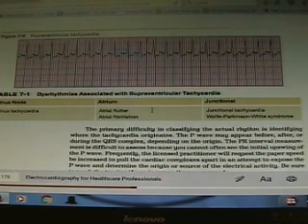And it's so fast that the previous T wave is wide, and so is the QRS. Know that trace. That is a very important trace. You see that, or atrial fibrillation with no history, you stop, you inform your chain of command immediately. Your patient will be symptomatic. That means it'll be obvious that there's something wrong.